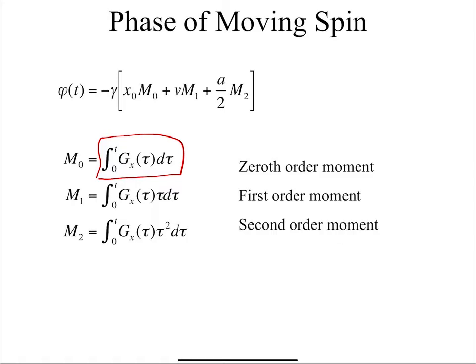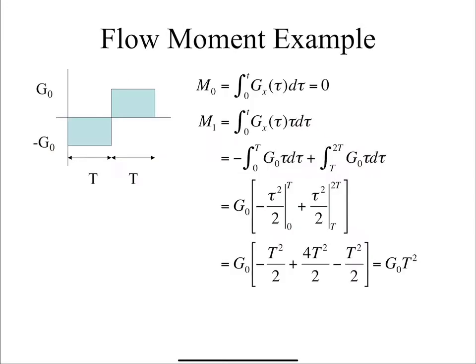Okay. So where am I in k-space at the end of that gradient? Center of k-space. Okay. So this is a bipolar gradient like this. M naught is equal to 0. Okay. So what we're really going to focus on is the 1st order gradient.